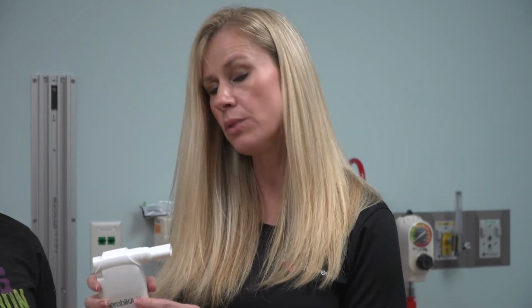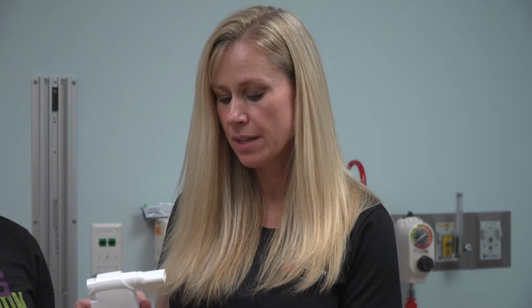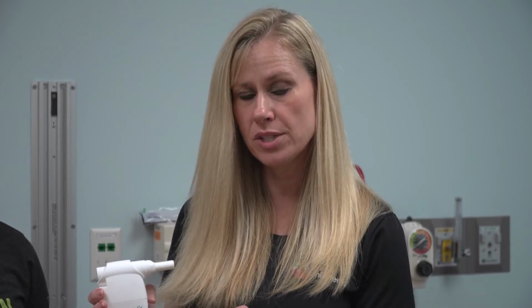When they exhale out, they want to try to keep their cheeks stiff. You really don't want them puffing out their cheeks because they're going to lose some of the resistance and the vibration in their cheeks as opposed to their chest where it needs to be. The goal for them is to do 15 breaths for 6 cycles, and they should do it consecutively. They should not stop to talk to you because they're going to lose some of that pressure that they're building up in their chest as they go through the cycles.